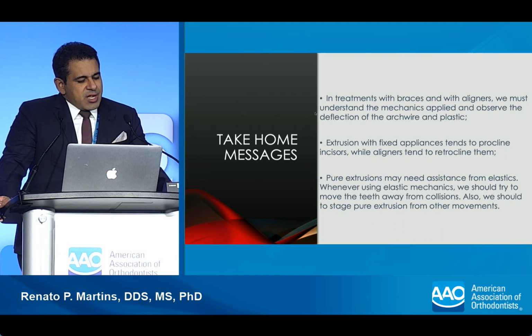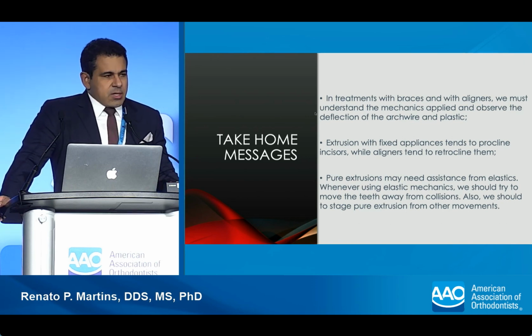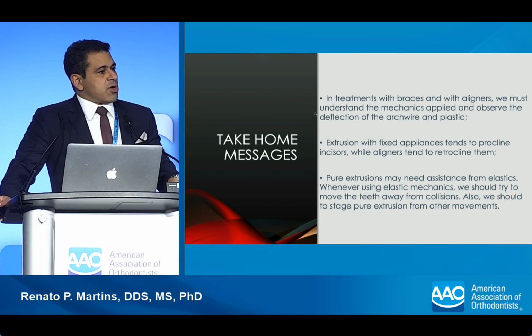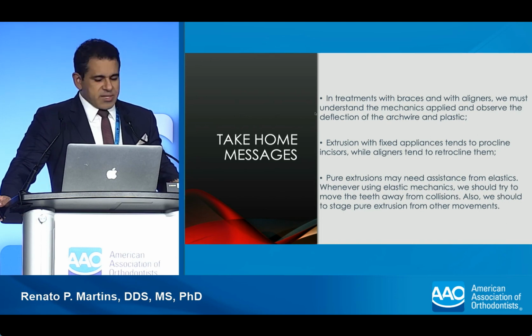And whenever using elastic mechanics, we should use the elastics moving the teeth away from collisions, interarch or intra-arch collisions. And also, another very important tip, whenever you're doing pure extrusion, if you choose to do it, always try to extrude the teeth by itself. Stage it. Do not mix it with rotations. Do not mix it with other movements. Use the extrusion by itself.